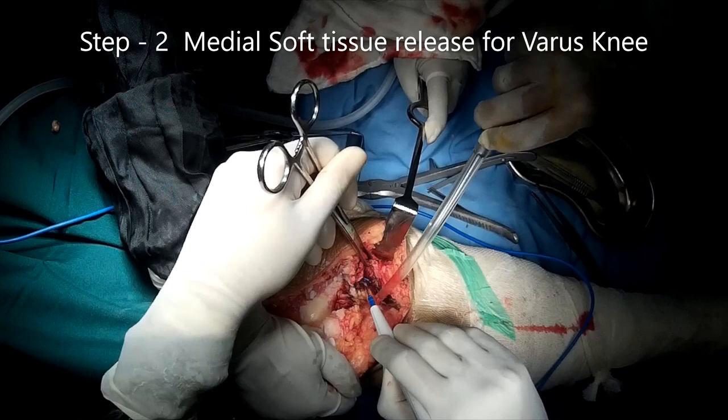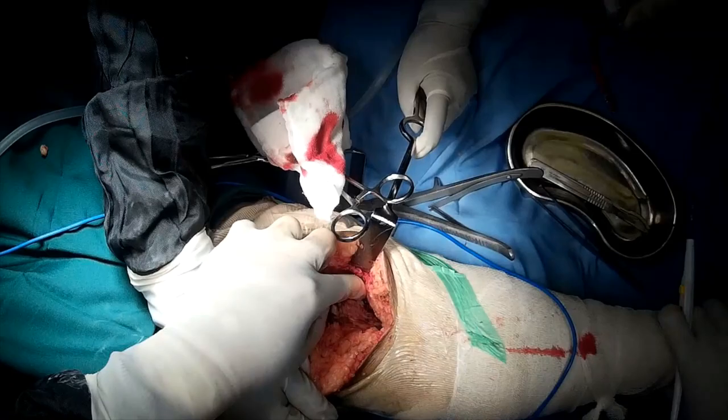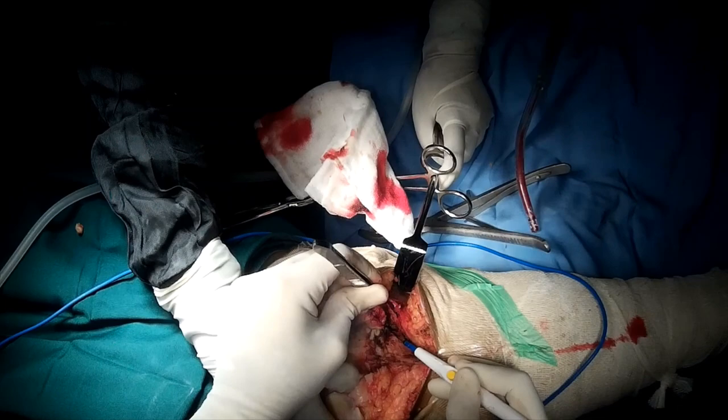This is a typical case of knee osteoarthritis leading to varus deformity and fixed flexion deformity. In this case, there is around 20 degree of varus deformity and around 10 degree of fixed flexion deformity. So here we are going to release the medial tight soft tissue from the proximal tibia by doing subperiosteal dissection.